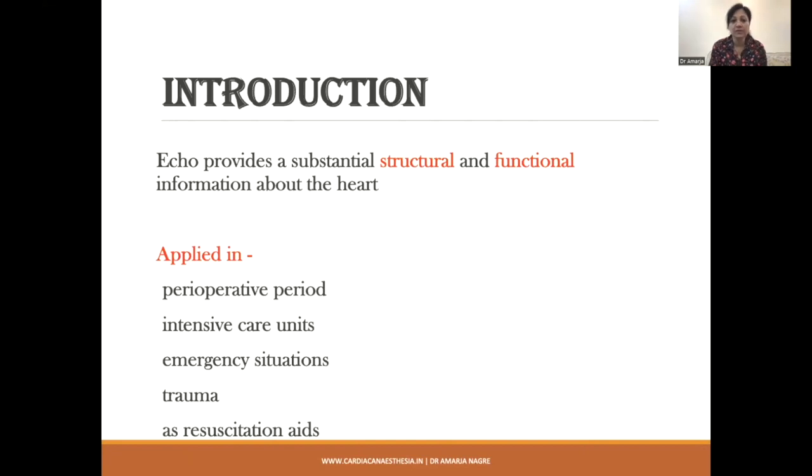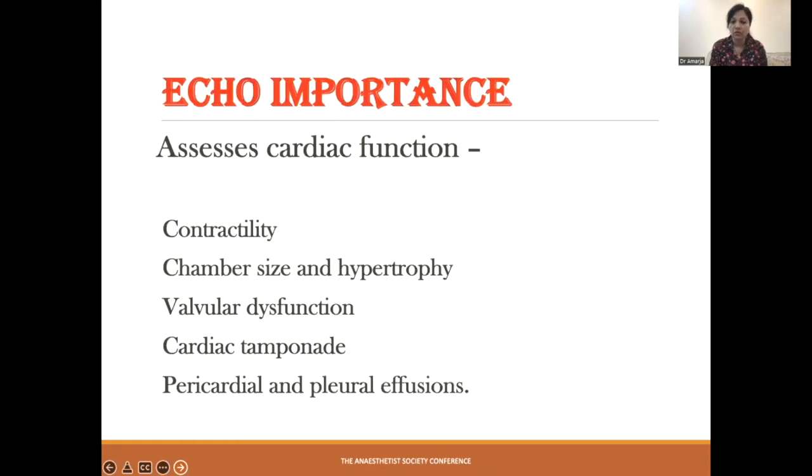Echo provides substantial structural and functional information about the heart. It can be applied in the perioperative period, intensive care units, emergency situations, trauma, as well as resuscitation aid. What does echocardiography actually assess? It assesses the contractility of the heart, which we very well know as ejection fraction of the heart.